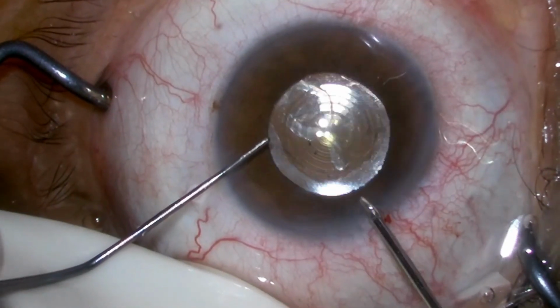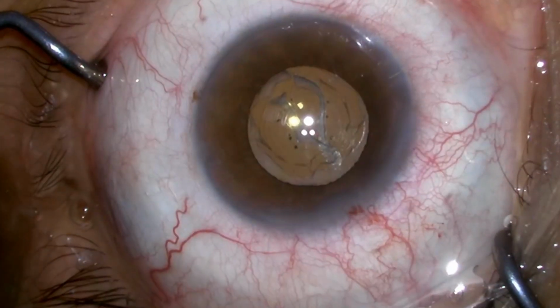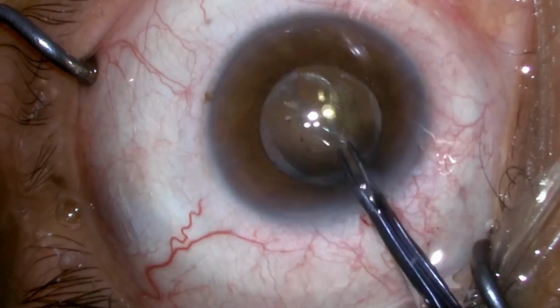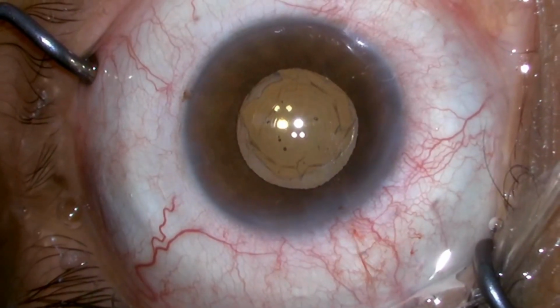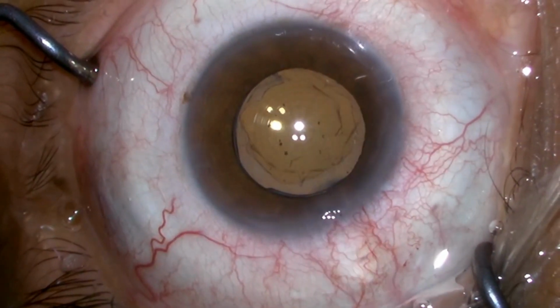Now this residual attachment we are cutting with micro scissors because there is a risk that the rhexis might extend. So now the anterior capsular margin is enlarged.